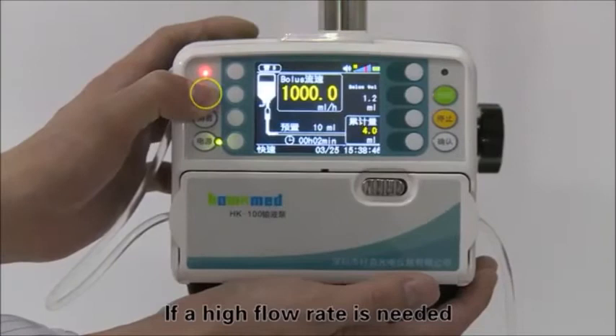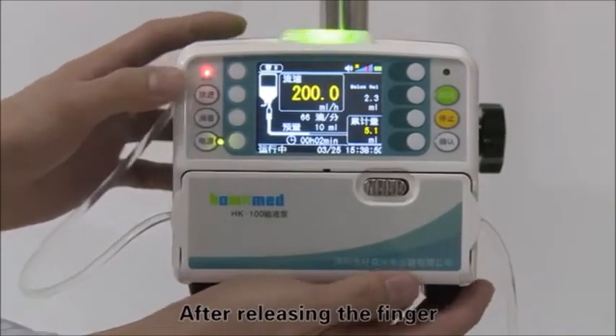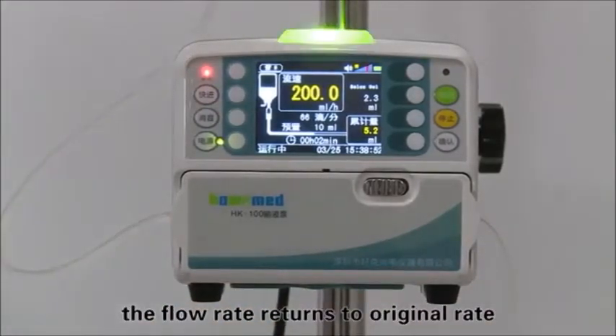If a high flow rate is needed, press and hold the bolus key. After releasing the finger, the flow rate returns to the original rate.